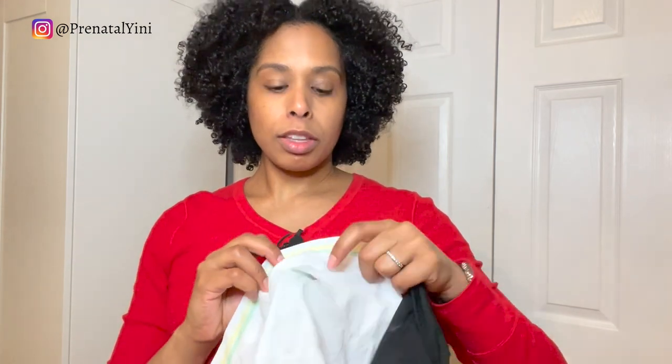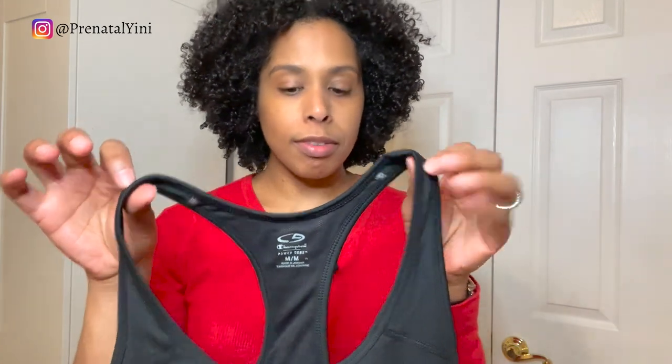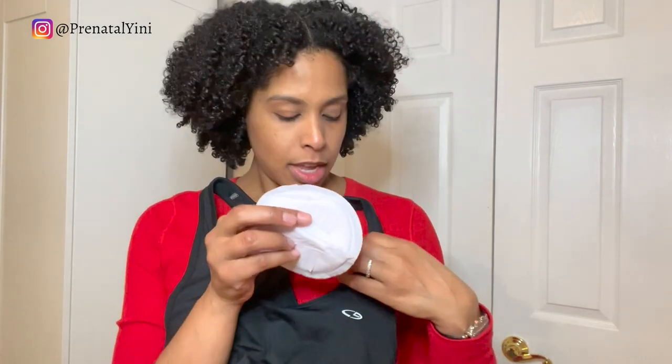If your flange is a two-piece style that disconnects, you can insert the flange from inside, place it, and then connect it to your pump. If it's a one-piece like the Spectra, Motif, or Baby Buddha, you'll need to make a larger opening so it can fit. Make sure the bra is not too tight or restrictive, and when you're not pumping, insert a breast pad or nursing pad to cover your breasts.